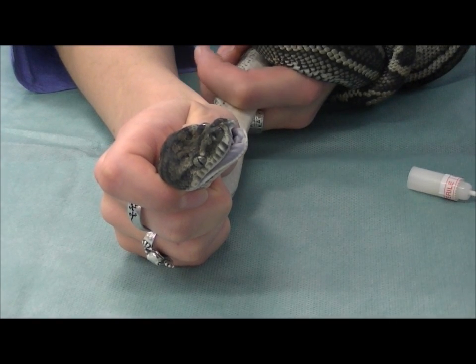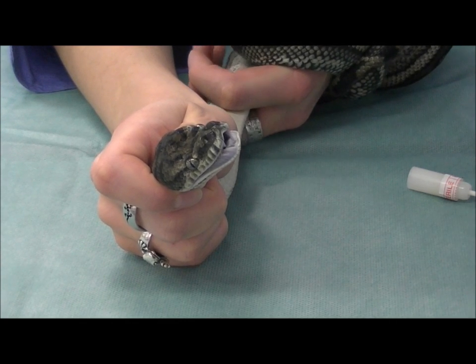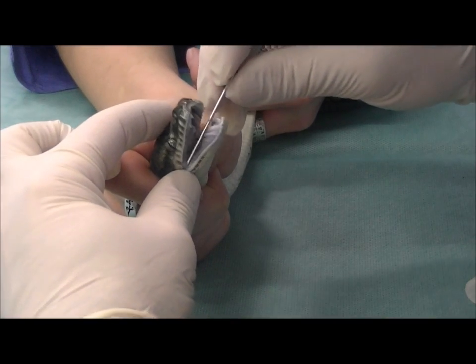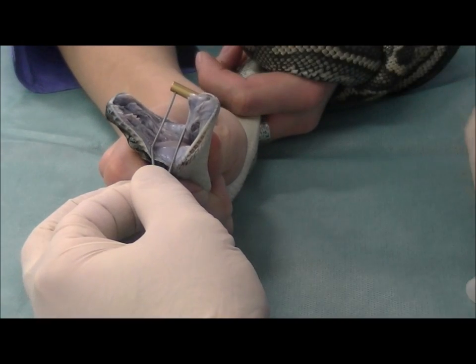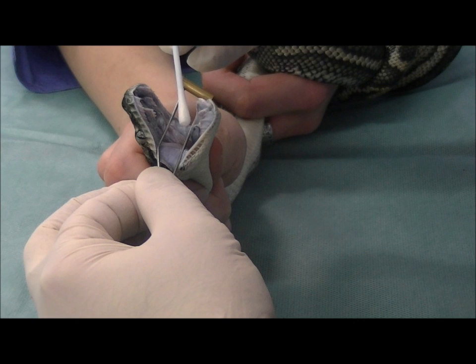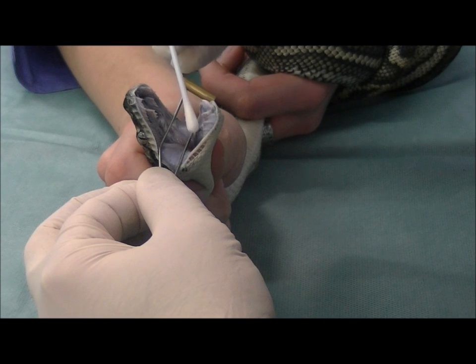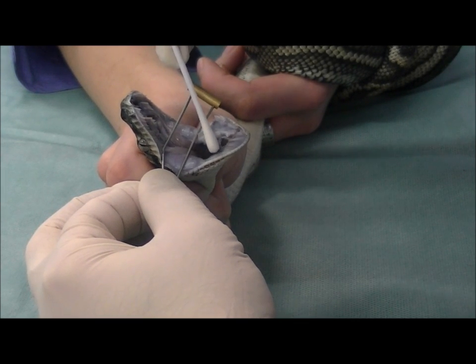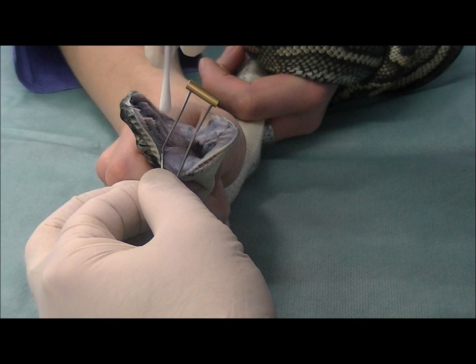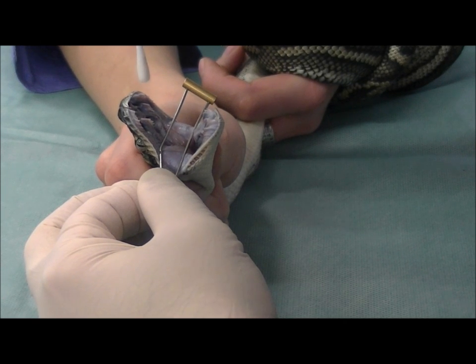We are now going to demonstrate how to take the mouth and cloacal swabs. Our demonstration snake is Selma, our coastal carpet python. Make sure you have all the equipment ready to go. We are going to use our mouth gags to hold her mouth open and use our sterile swab. In larger snakes, ideally you try to take the sample down inside the windpipe, then the rest of the mouth. She is not big enough for that, but we are going to swab around the windpipe — what is called the glottis — and get some good samples from there. We are going to rub the swab along her lip and mouth, going from her nose towards the back, so the swab won't catch in the teeth.